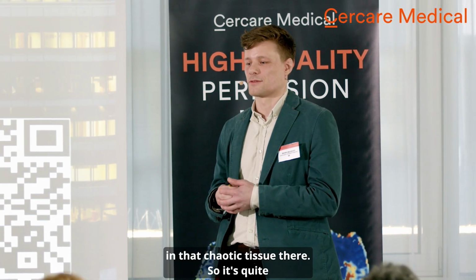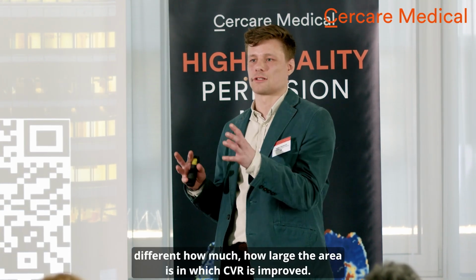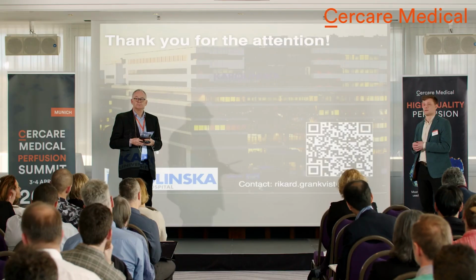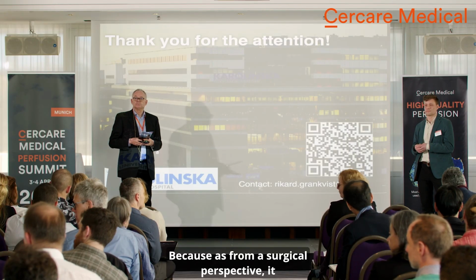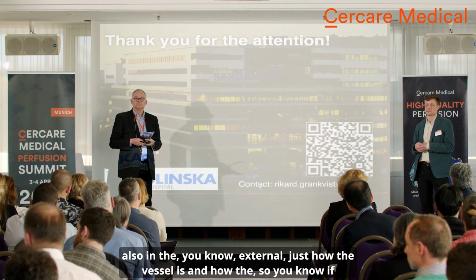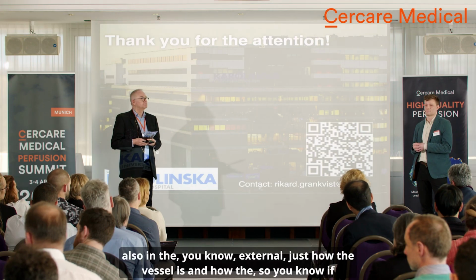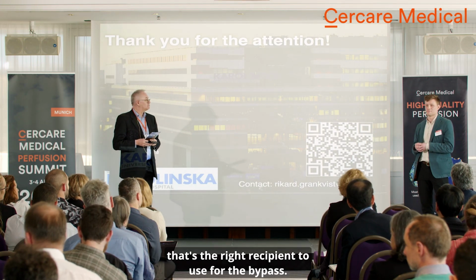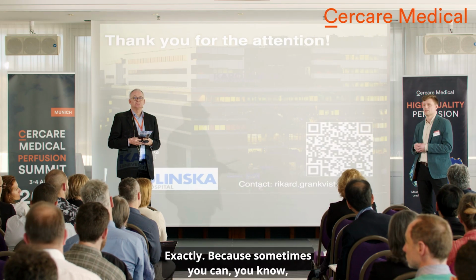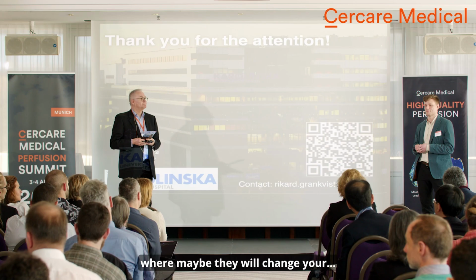So it's quite different how large the area is in which CVR is improved. From a surgical perspective, it will be interesting to see the MR perfusion also in the external carotid territory, to see how the vessel is, and whether that's the right recipient to use for the bypass. You mean if it has enough flow?